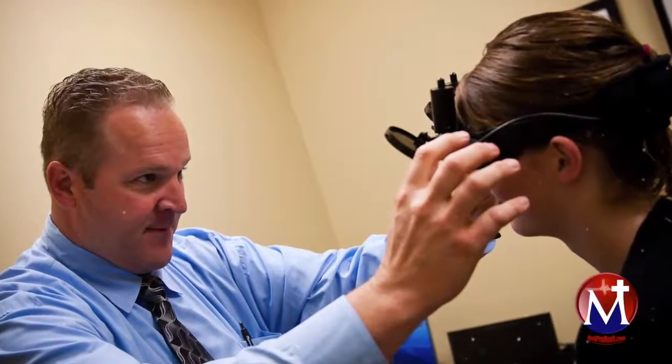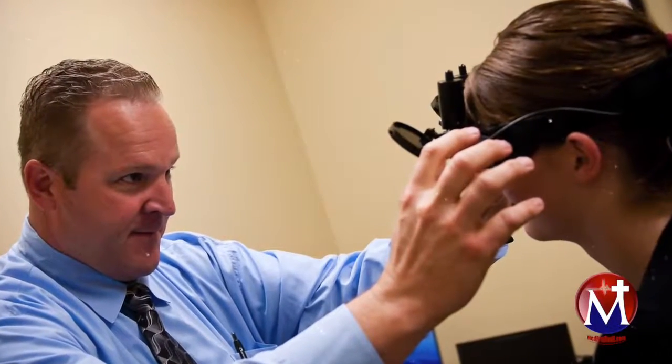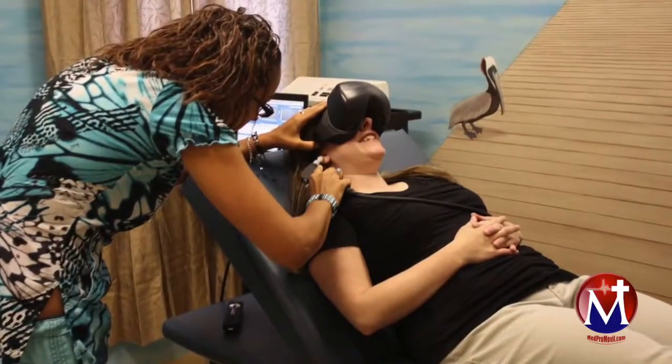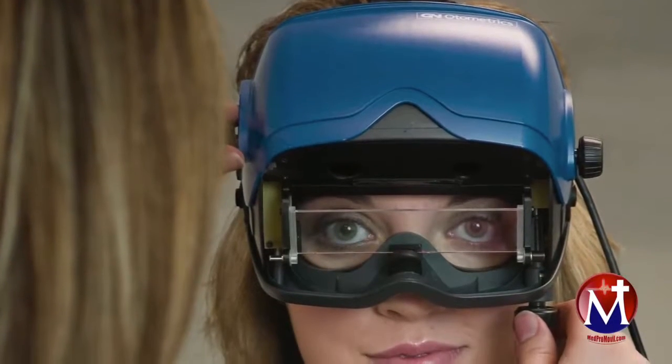Different regions of your brain control different types of eye movements, pupillary response, and optokinetic function. Through video nystagmography, we are then able to analyze and determine where the deficient regions of the brain are. From here, we're able to develop training programs to revitalize the problematic areas, harnessing brain function through eye exercises and other therapies. It is important to understand that general eye movements are not therapeutic to the brain in most cases.